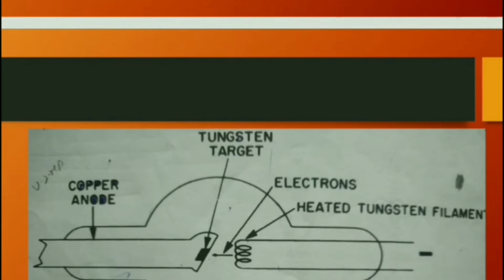It occurs when a fast moving stream of electrons suddenly decelerates in the target anode of an X-ray tube. Here the anode is a part of the X-ray tube that we use in diagnostic X-rays, sorry, not to capture the image, to produce X-rays.